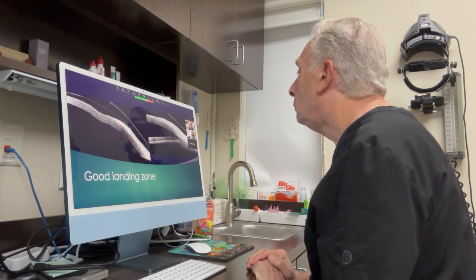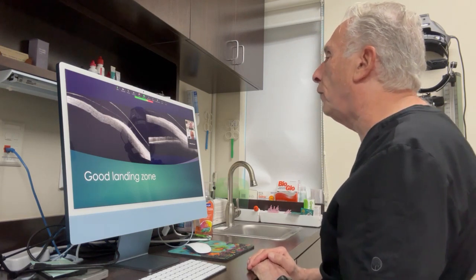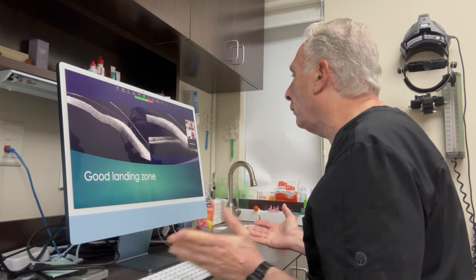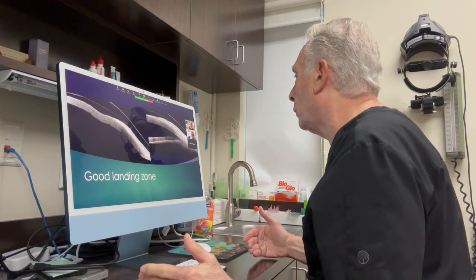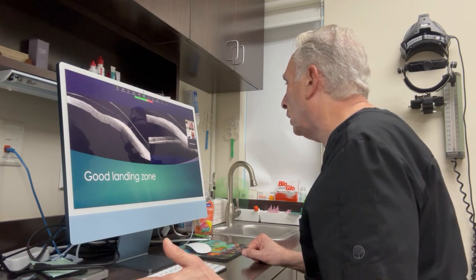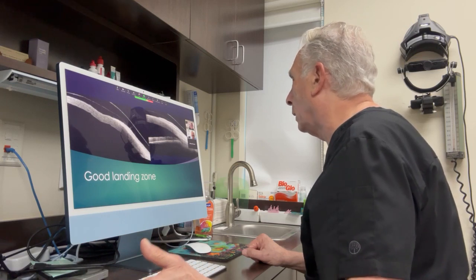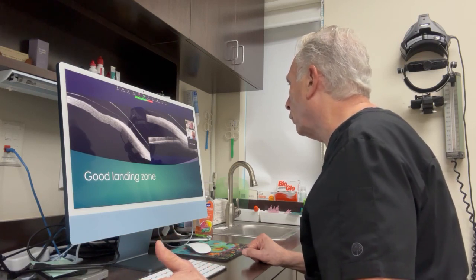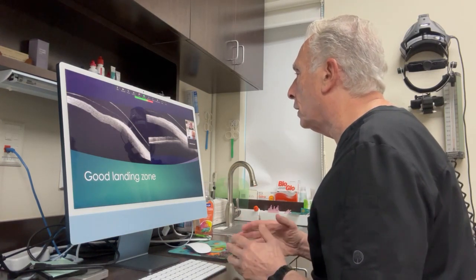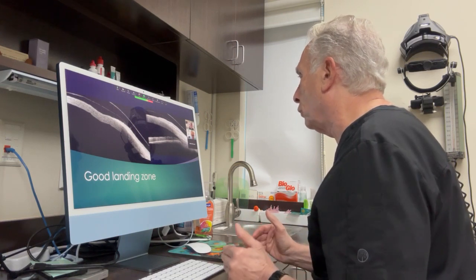So you don't use trial lenses at all? My diagnostic lenses are all four diopter reverse. The trial lenses I use a lot are Jupiter scleral lenses. I have them in all diameters: 15.6, 16.6, up to 18, and also 20 millimeter scleral lenses, but they're all reverse geometry. A little thing I've learned over the years: my life is easier when I design lenses with reverse geometry design.